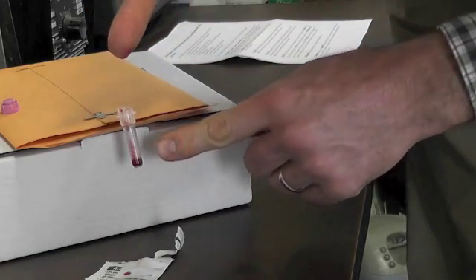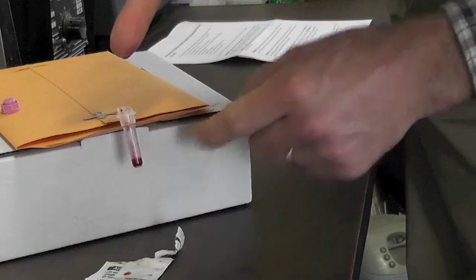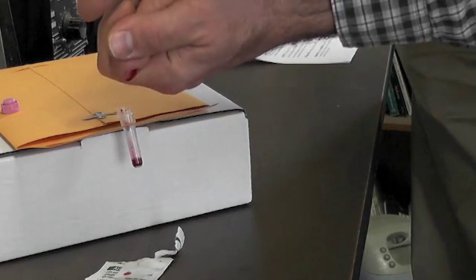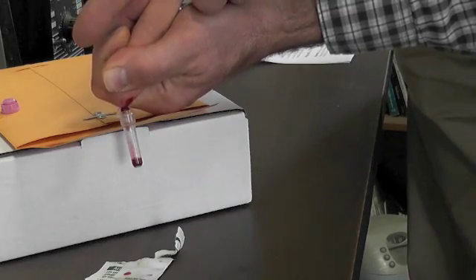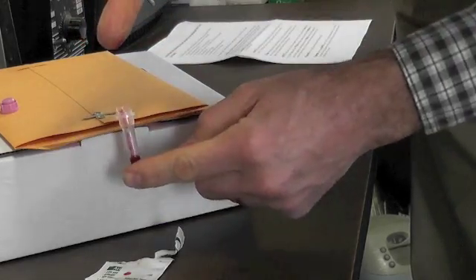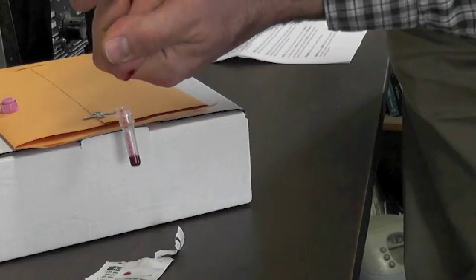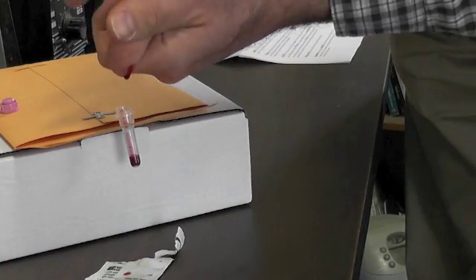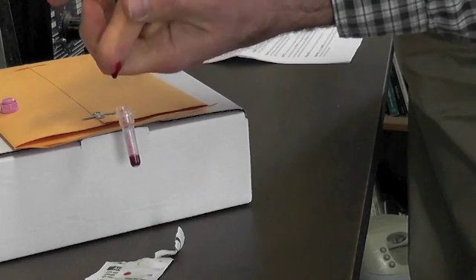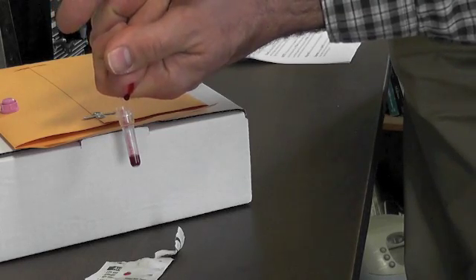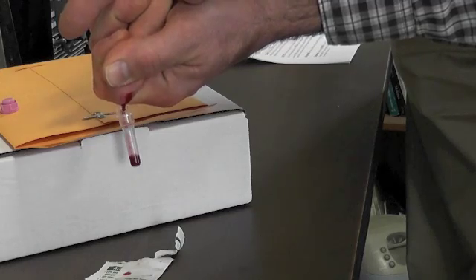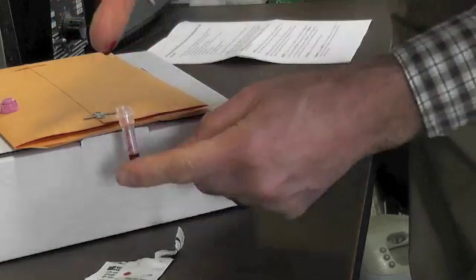You're aiming for the first line that says 250, or just the clear line. That's what you're looking for. Get a nice sample there. It looks like I need a little bit more, so I'm going to get another drop. Just squeeze gently, you don't have to squeeze very hard. It's good to get all the way around the finger, just squeeze that out and drop that in there.